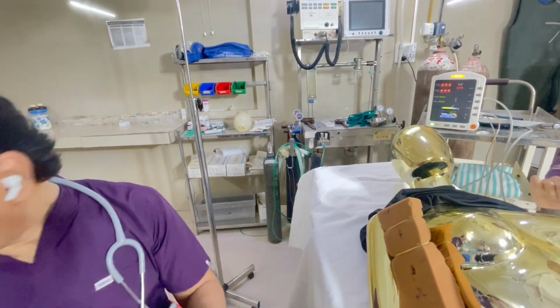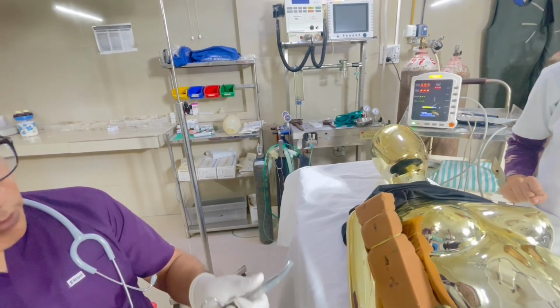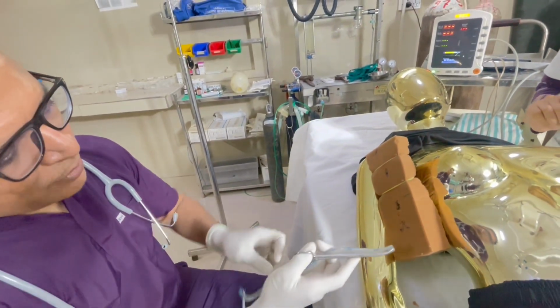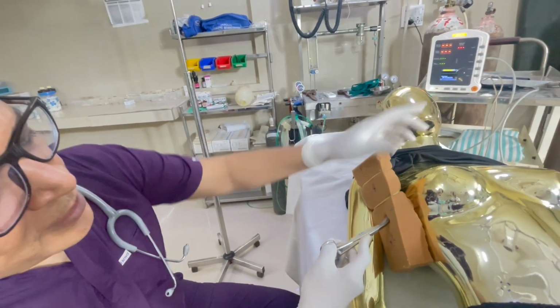See that the distal end of the drain is clamped with the forceps, so that a sudden gush of air will not leak. You have to direct this towards the upper side, toward the opposite shoulder.